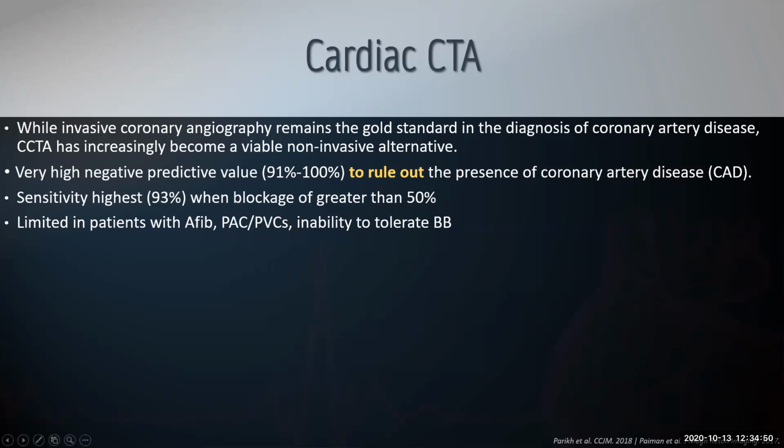So they're using the concurrent ECG to try and time when the contrast is in the coronary vessels. So yeah, I agree. It's the fact that there's going to be some motion artifact, but it's really going to be the fact that they're trying to time the PQRST with the contrast, and it's going to be hard for them to be able to get that P on there if that patient doesn't have P's because they're in AFib.